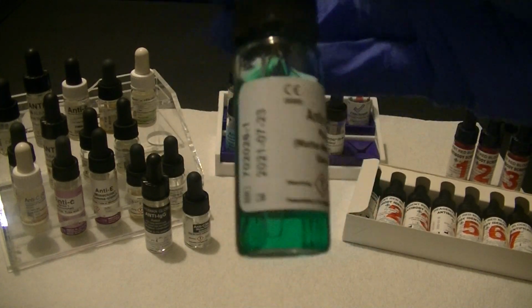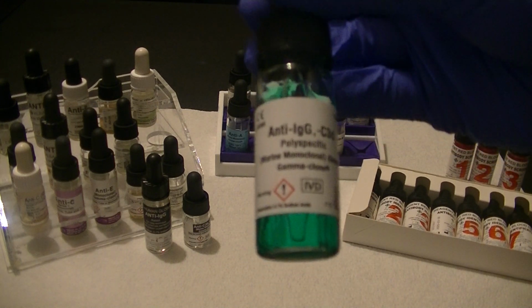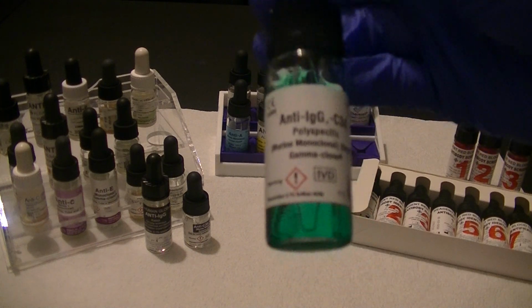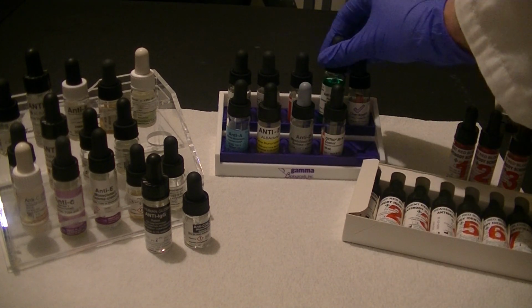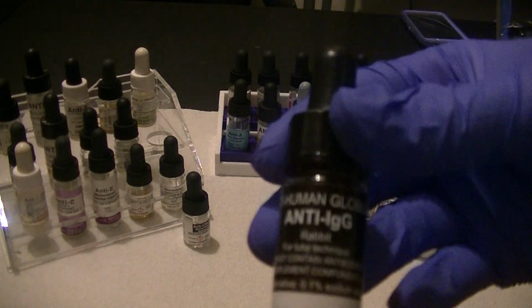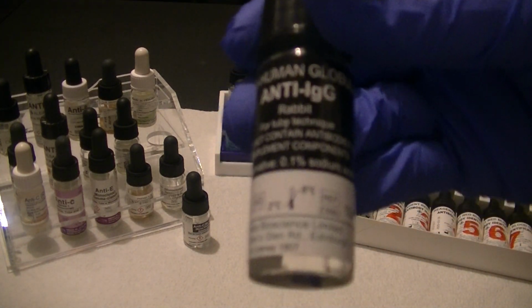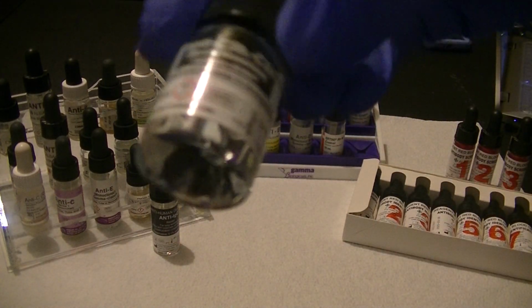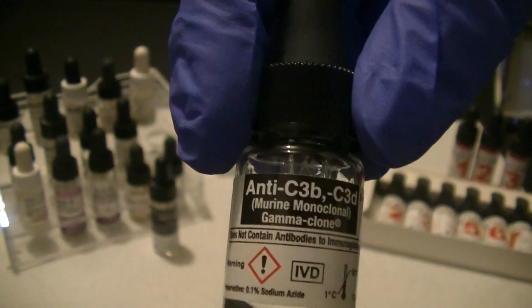So we have anti-sera that help us to detect if an IgG antibody is present in a person's plasma, because these antibodies help the IgG cause agglutination by cross-linking cells. We will learn more about that test tomorrow in lab. There are anti-sera that have just the antibody to IgG, or an anti-IgG. This is still known as anti-human globulin, or AHG. Or we can have antibodies that will bind just the C3 that may be present on a person's red blood cells.